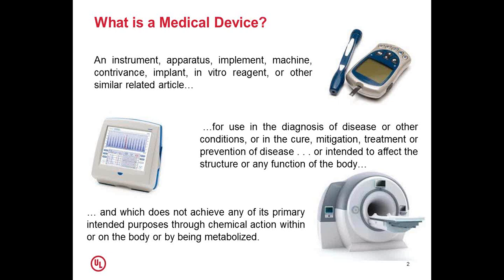You can see the medical devices here. On the first right side you will find a glucose meter, which is an in vitro diagnostic, and the next one is ECG and an MRI. All of these actually fall under a medical device.